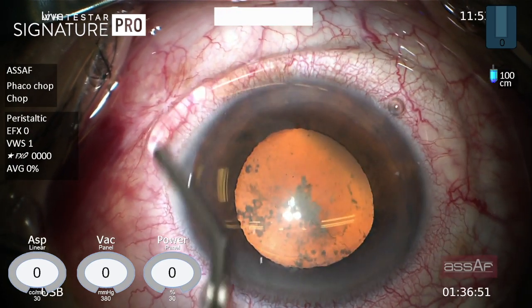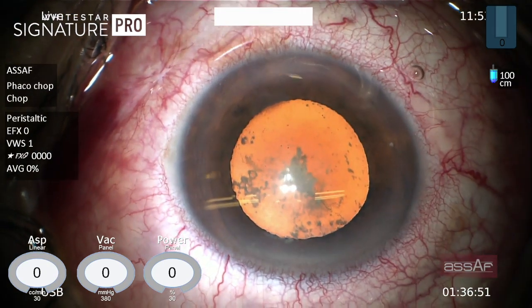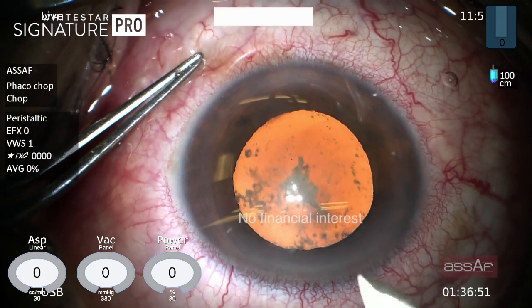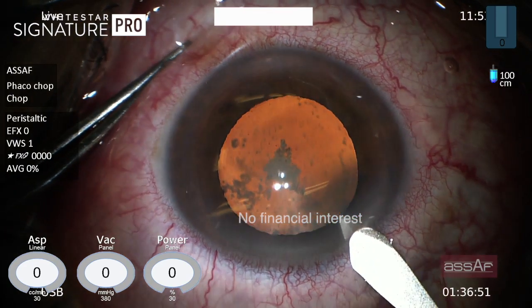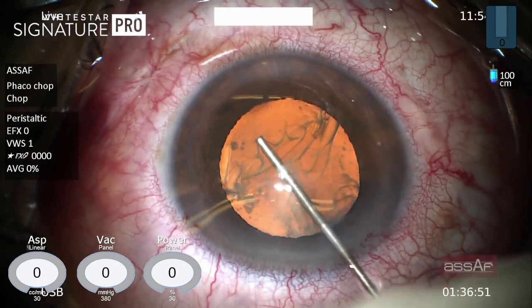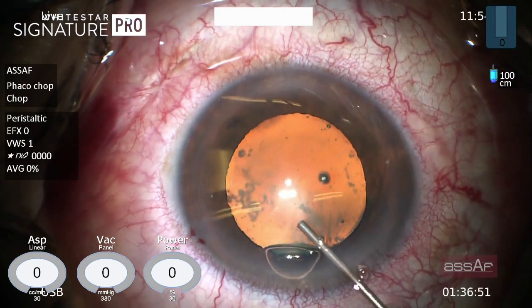This eye had a beautiful uneventful vitrectomy followed by silicone oil removal, and the patient complains of diminution of vision because of cataract and asks for cataract extraction. As you can see, some of the emulsified silicone oil bubbles are seen inside the anterior chamber under the dome of the cornea, which is quite common in such cases, and this can be washed out easily by injection of dispersive OVD inside the anterior chamber.